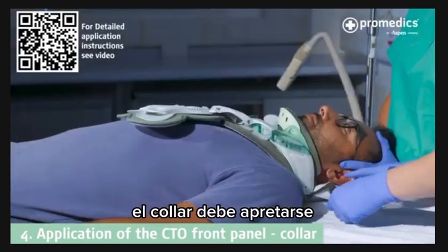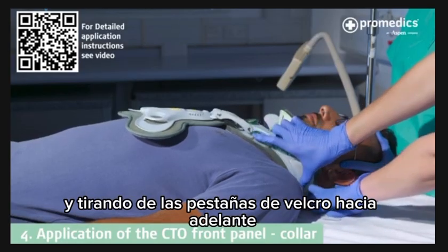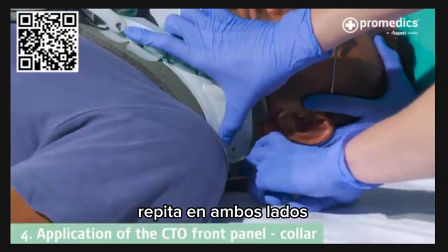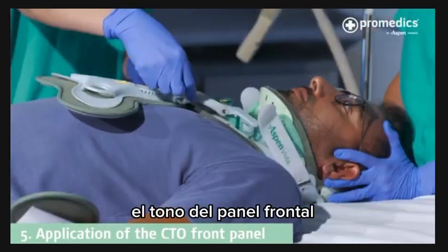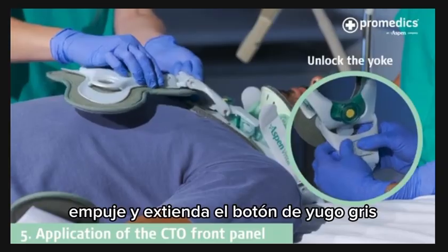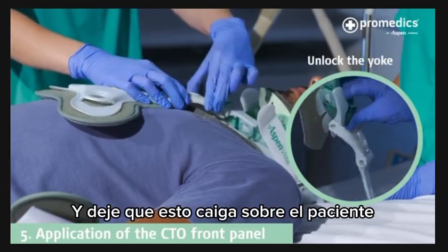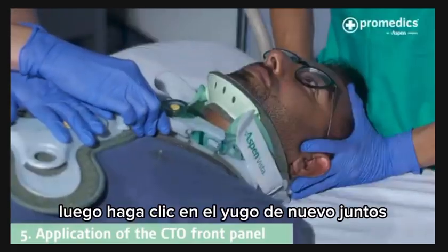The collar should be tightened by tucking the side panel around the neck and pulling the Velcro tabs forwards. Repeat on both sides. The pitch of the front panel can be changed to suit the patient's anatomy. Push and spread the grey yoke button and allow this to drop onto the patient. Then click the yoke back together.